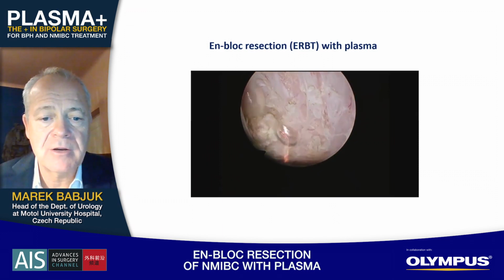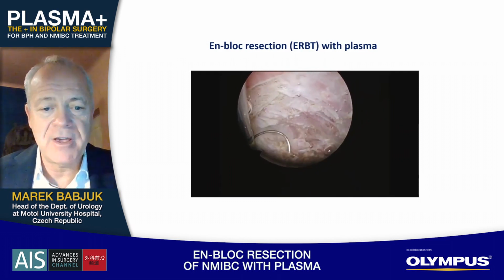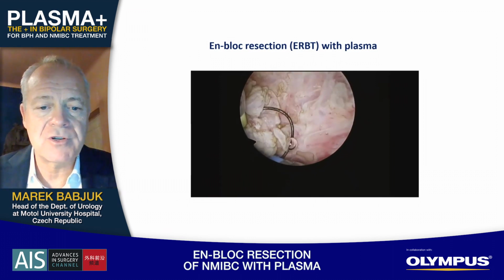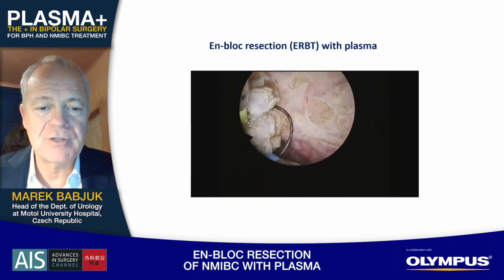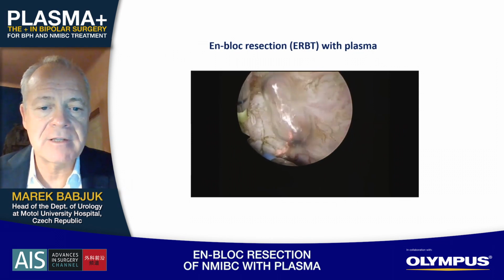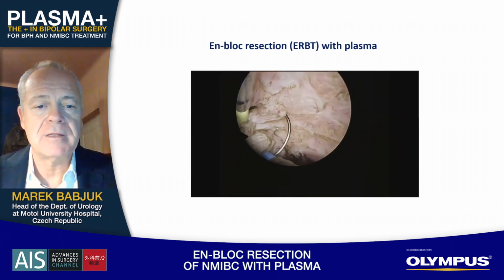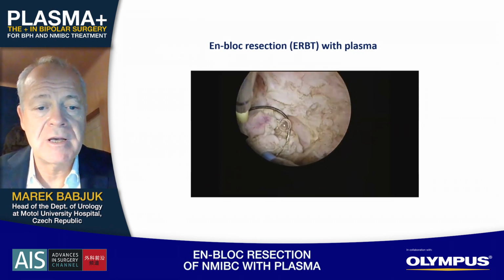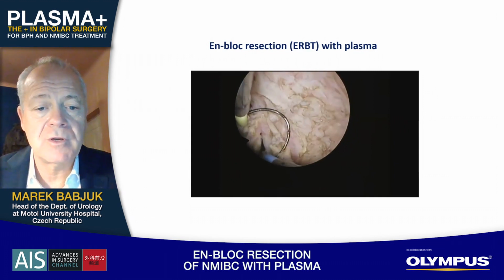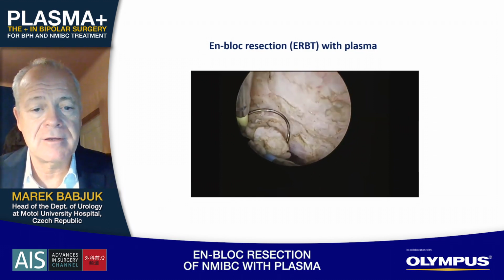But you may see that this is always a controlled surgery. We continue with very short cuts. It is really a very short activation of the electric current, so this is always very controlled surgery. You can, in any second of the procedure, really control how deep you are, whether you really have muscle, at least visually muscle, and whether the resection is complete. And so this is a controlled surgery, which is of course an advantage not only in complication rate, but also as a teaching process, so that you can very easily teach that to your young residents.